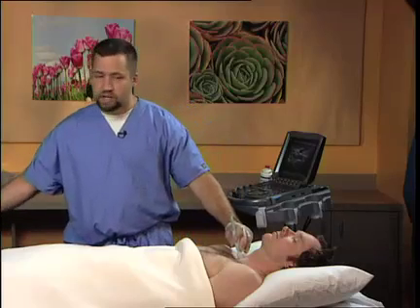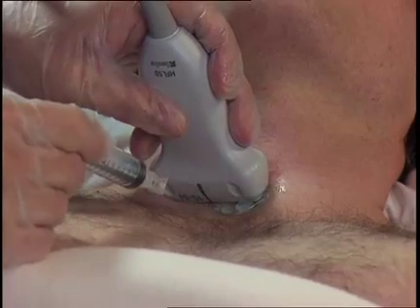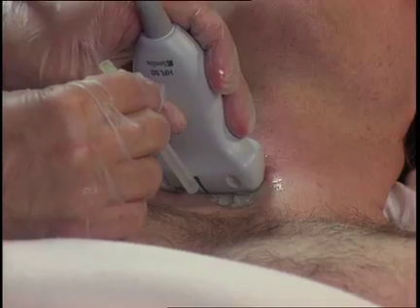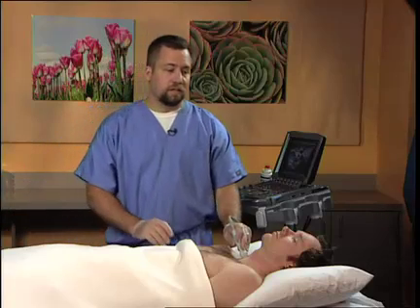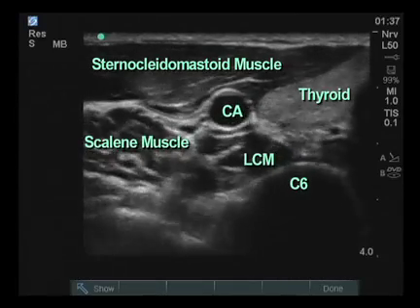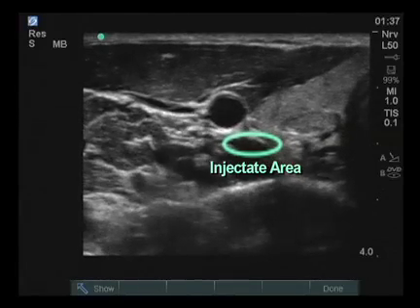At this point, local anesthetic 1% buffered lidocaine is injected and a 25 gauge 3.5 inch needle is advanced through this track to contact the osseous surface at C7. The needle is backed off slightly and then the injection of local anesthetic, preferably epinephrine-containing 1% lidocaine, 6 to 7 cc's, is gently and slowly injected.